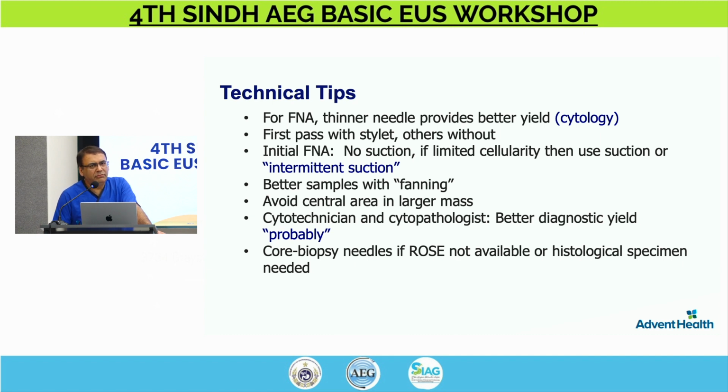I think I probably misspoke on that. Yes, you have to pull it back. What I meant by that is, because the stylet is in there, I would not tell them to take it out completely. What I meant was that I'll leave it in, but you have to move it back up a centimeter or two because the stylet goes beyond the needle. That is just to protect the sharpness of the needle, and it's a safety measure as well. So you have to pull it back.